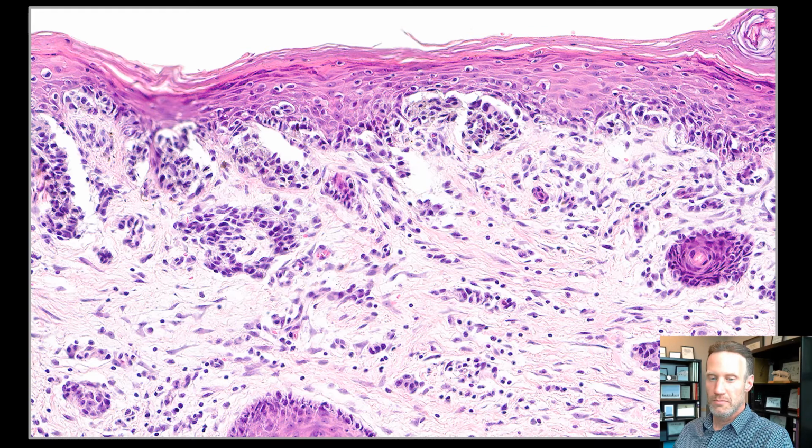That alone might not convince me that this was melanoma, but extensive pagetoid spread should usually raise the level of suspicion significantly, regardless of the presence of a scar or other evidence of trauma or irritation, particularly in a patient who's 60 years old.